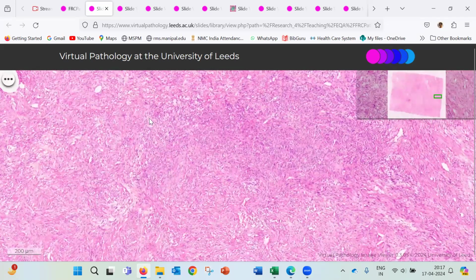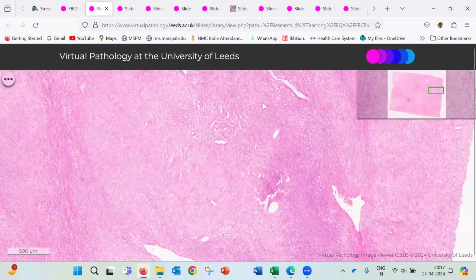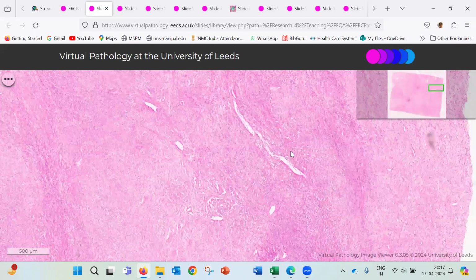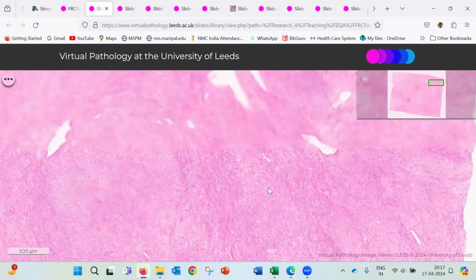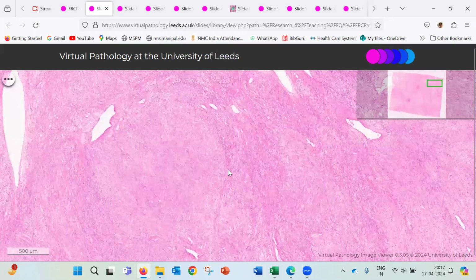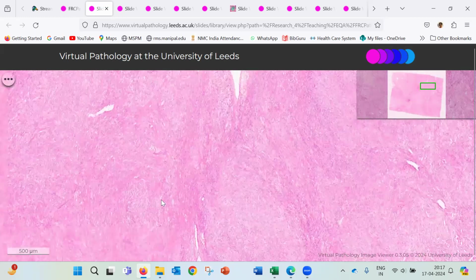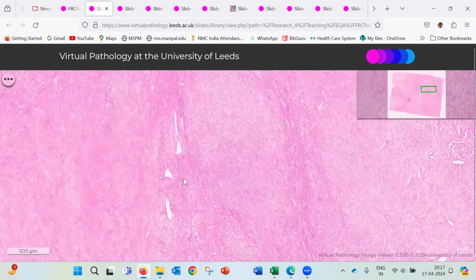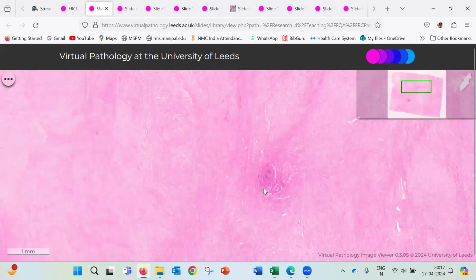So this is an SFT, a solitary fibrous tumor, and you say that I will do a CD34 particularly for this case, even though I don't consider synovial sarcoma because I don't see any mitosis, any hypercellularity, any overlapping epithelial or biphasic pattern. But I will do a CD34. I expect this to be a strong positive. I will do a STAT6 rearrangement to confirm, particularly for this case.